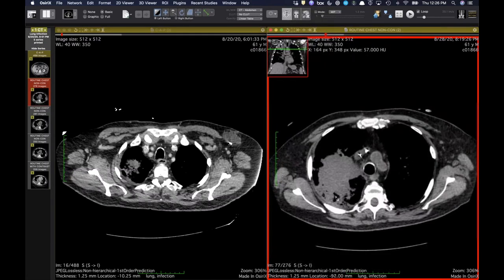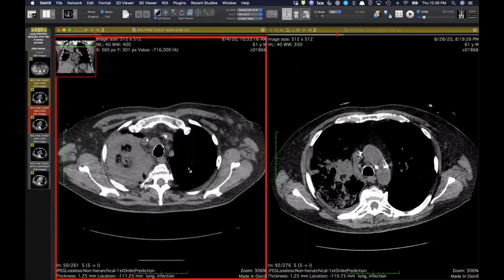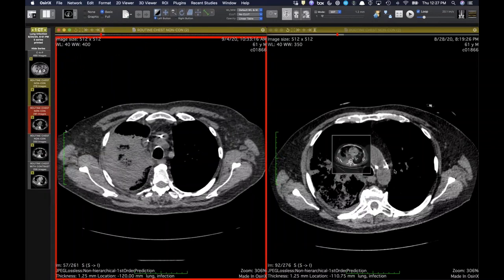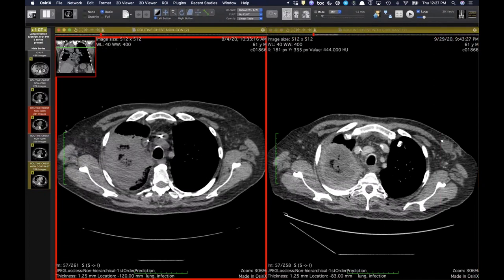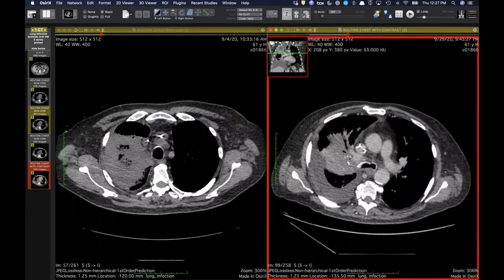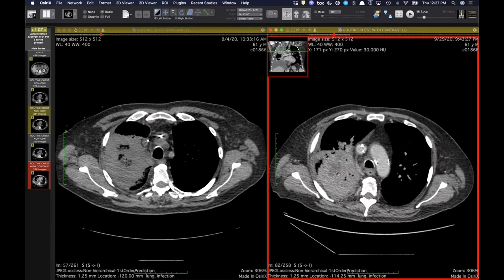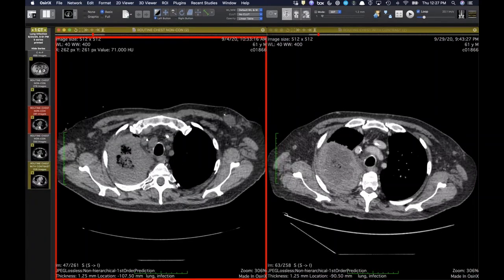And you can see how dense this consolidation is. So this progressed a little bit, and then they eventually, this is a few weeks later, you know, certainly we were coming down very hard on this being mucor, and obviously the implication of mucor versus aspergillus or other fungal species can just be a difference in putting them on amphotericin or other heavy duty antifungals. And this was at the end of this month, and you can see this was one where contrast was given, and you kind of just lose the arteries in here. There's no macroscopic occlusion, you just lose things going into there. But they ended up doing a lobectomy and confirmed that there was mucor with vascular invasion here. So this all was necrotic lung parenchyma from angioinvasive mucor species.